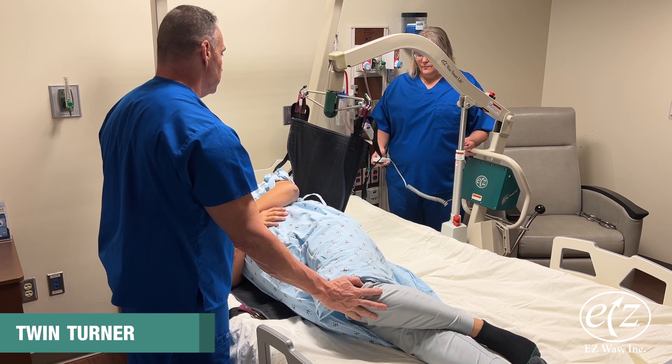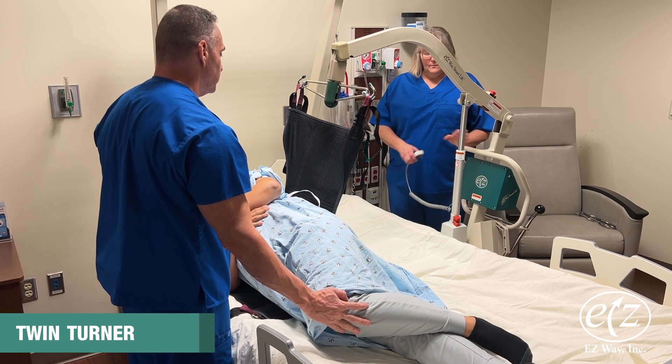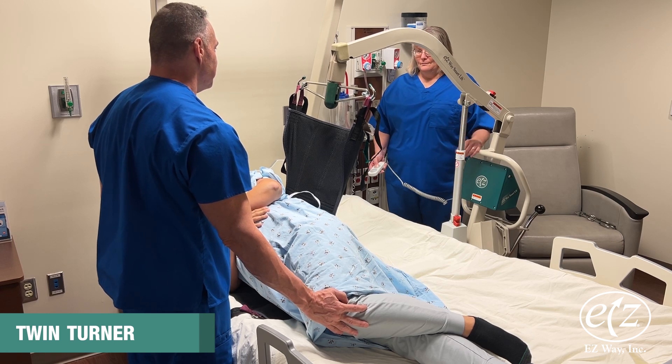Continue raising the lift to slowly turn the person onto his or her side. If needed, support the head with a pillow.